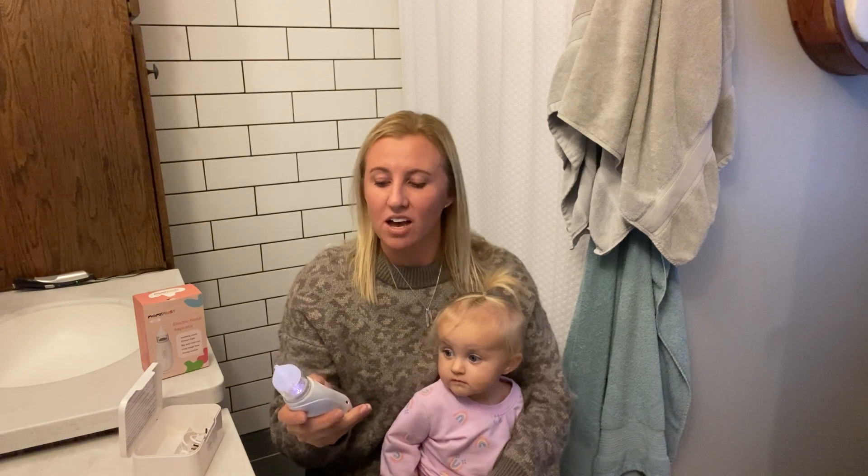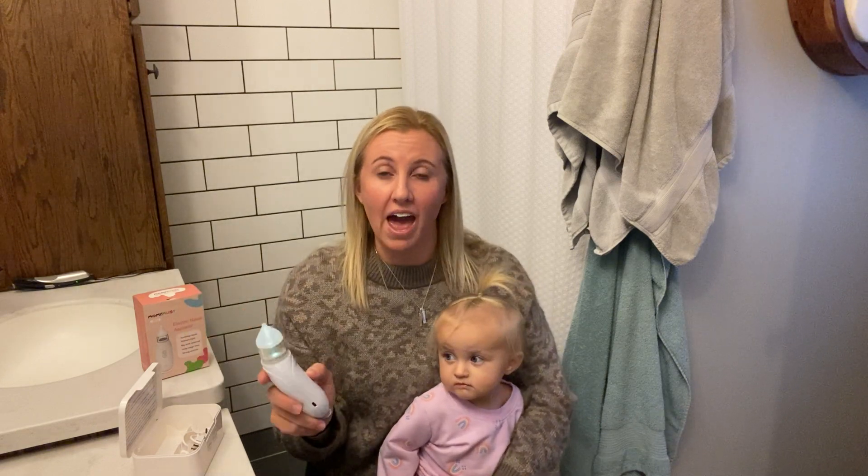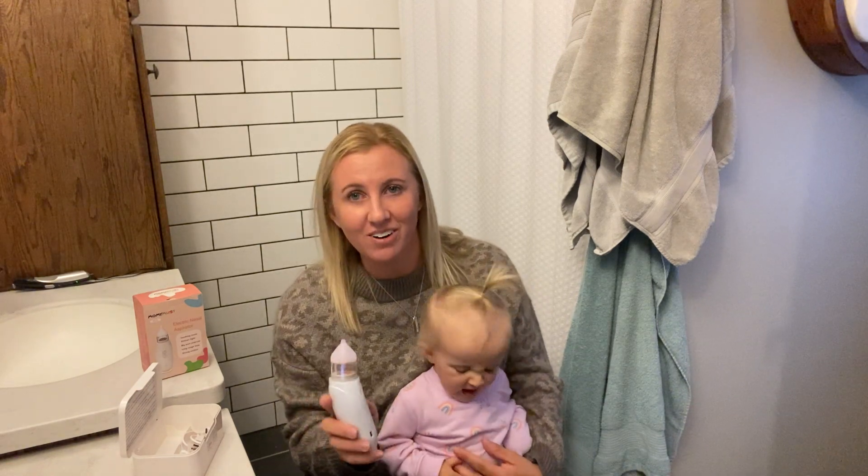Also, a great feature with this thing — it comes with a built-in light and music function. So it really distracts the child as they are getting their nose sucked. I'm going to show you right now how it works.